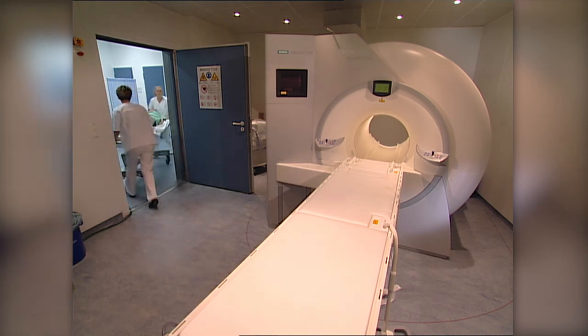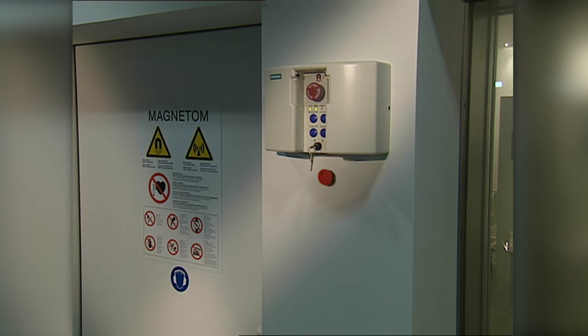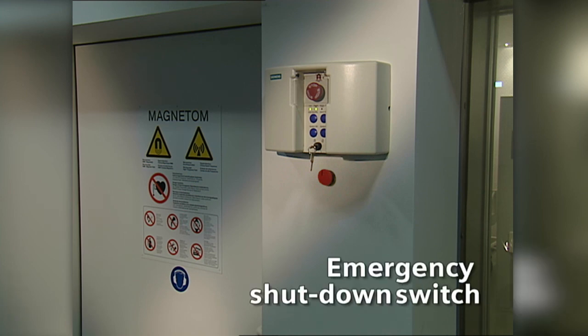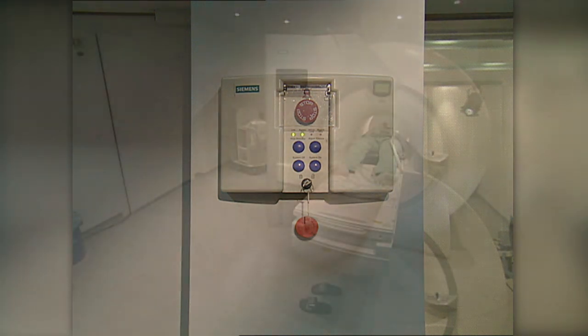In case of an accident caused by the electrical equipment, or in case of damage, press the emergency shutdown switch. In this example, the switch is located at eye level near the entry and exit points. Use it to disconnect the imager electronics from the line voltage. This does not turn off the magnet.